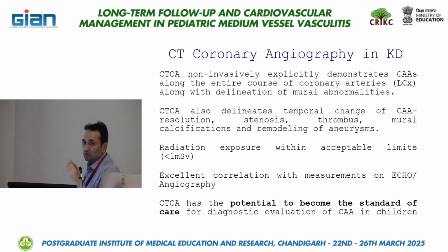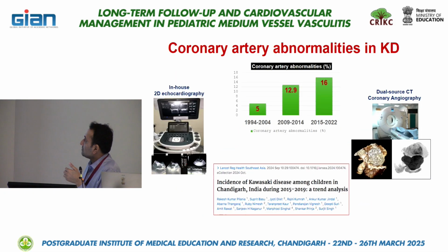You must have seen Dr. Suda has just shown in the previous talk how she has compared the CAG and CT angiography diameters, which are almost comparable. So CTCA has the potential to become the standard of care for diagnostic evaluation of coronary artery abnormalities in children where it's applicable.